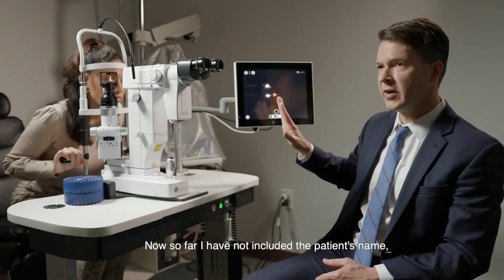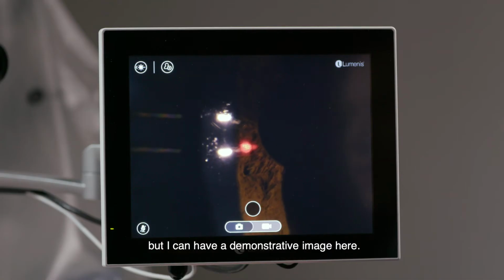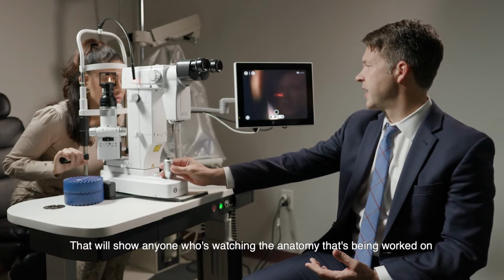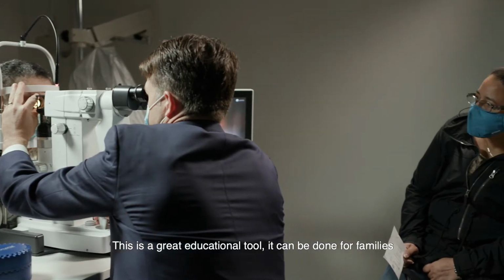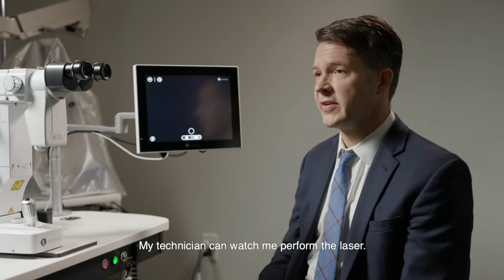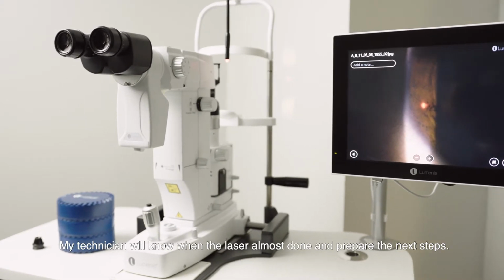Now, so far I have not inputted the patient's name, and so I can't capture video or photographs, but I can have a demonstrative image here that will show anyone who's watching the anatomy that's being worked on, and they can live view the procedure. This is a great educational tool. It can be done for families who are interested in understanding what's happening with the procedure. My technician can watch me performing the laser. My technician will know when the laser is almost done and prepare the next steps.